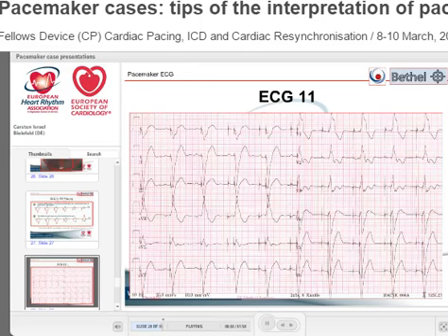So I said, okay, come on. And it was a single lead. He had paroxysmal atrial fibrillation. I said, let's implant transvenous leads, dual chamber. And I asked him, do you have any documents of your operation? He said, no. The operation was 53 years ago.